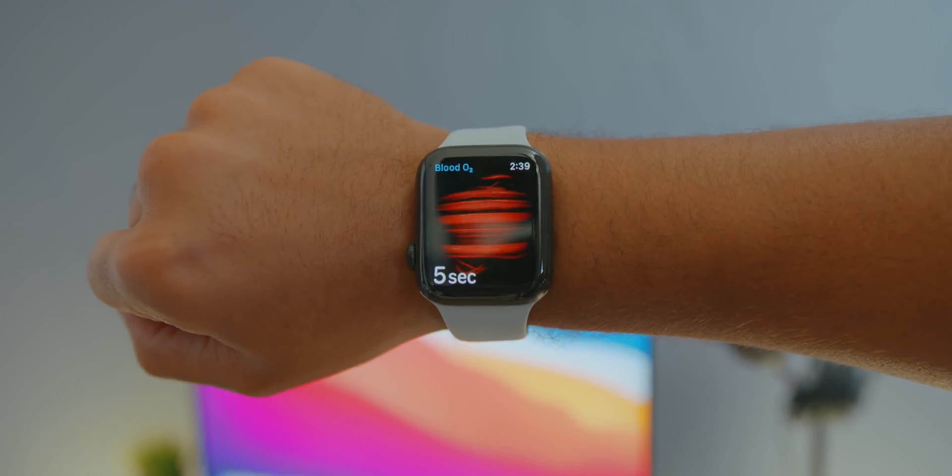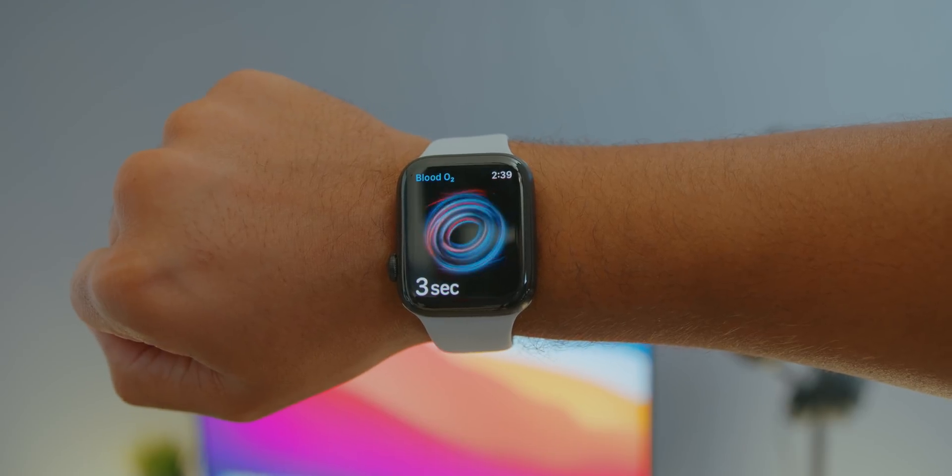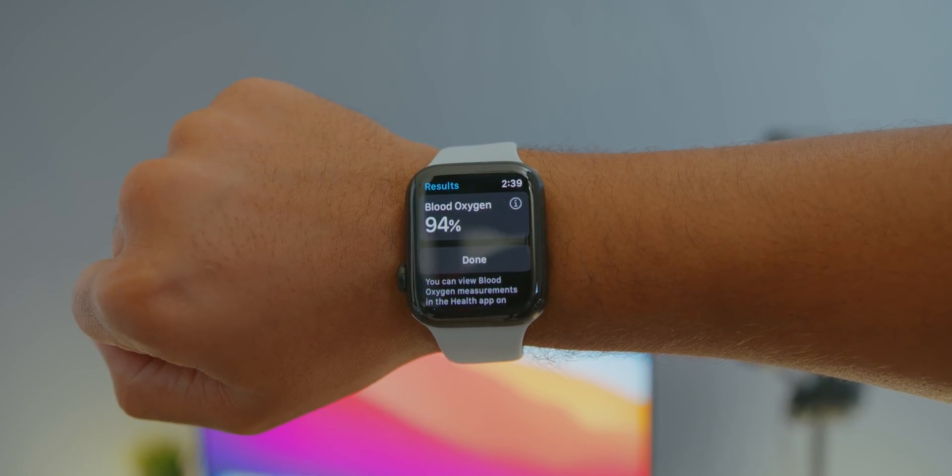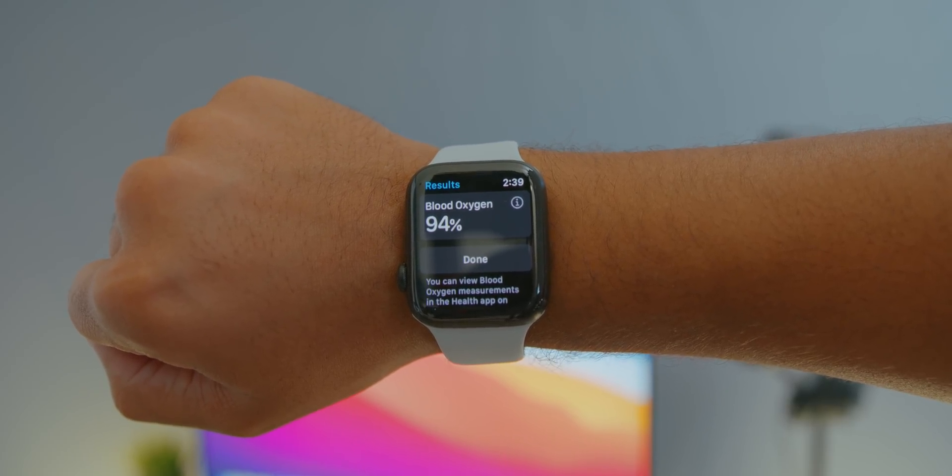One thing I will say is that if you get a poor result with this specific test or an ECG test on your Apple Watch, maybe run the test three more times. If two out of three results yield bad results, I'd seriously recommend seeing a health professional, because most of the time these results from the Apple Watch are very good signs that you may have a deeper issue. Those were our tests on the Apple Watch Series 6, and I hope those answer some questions about whether the blood oxygen level tests are accurate or not.